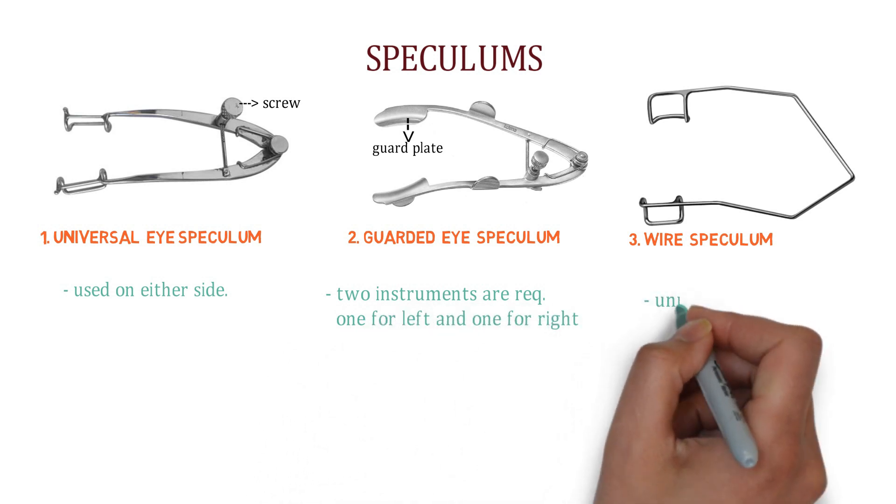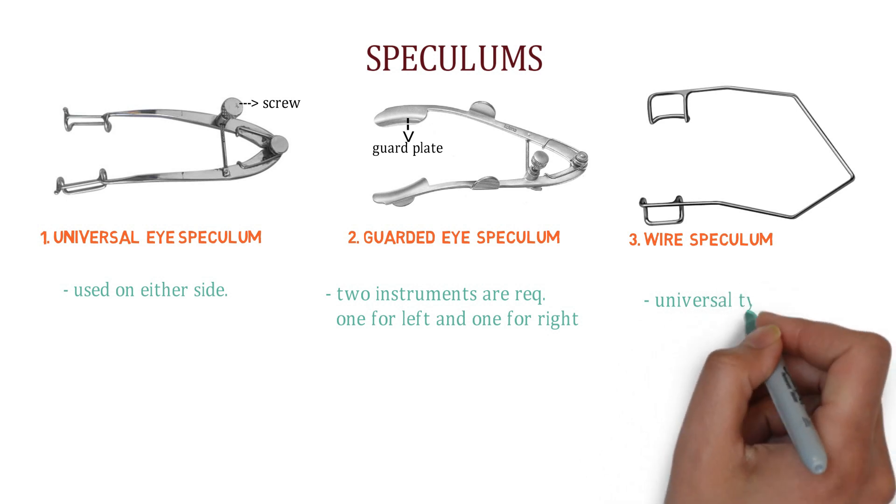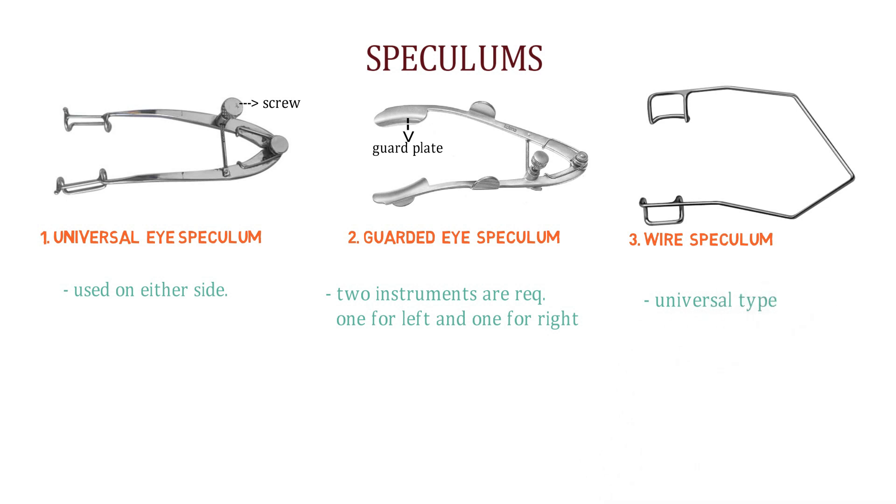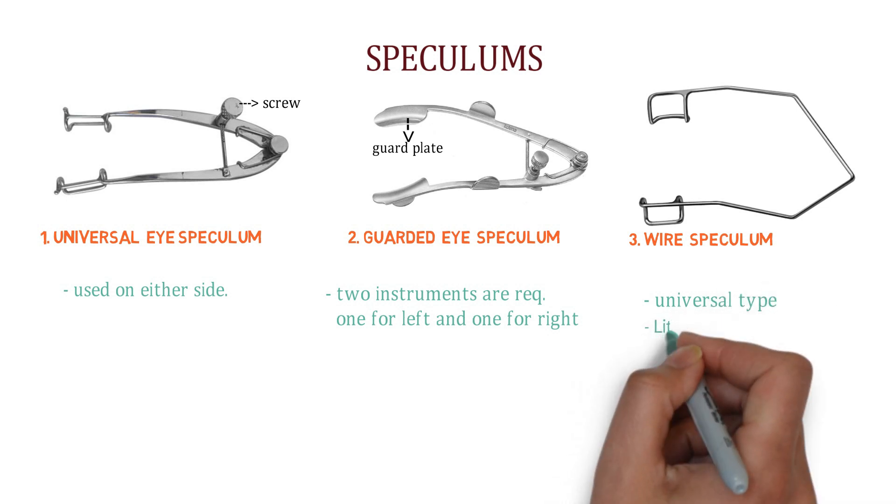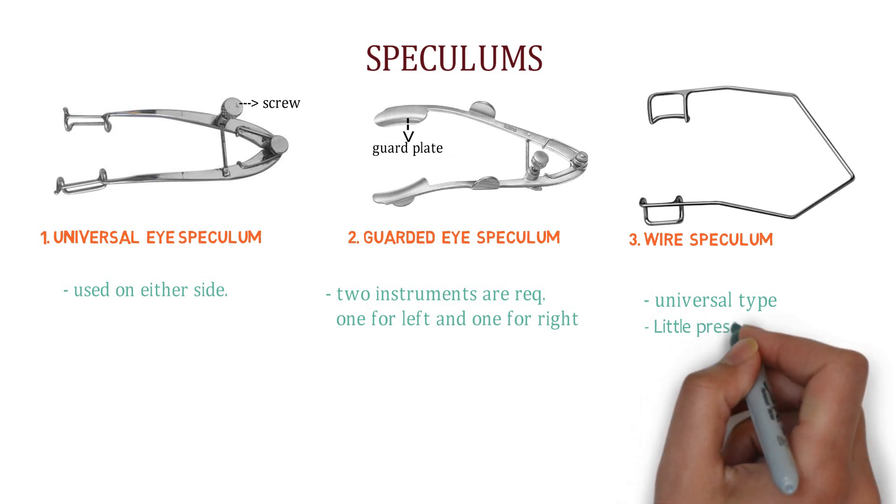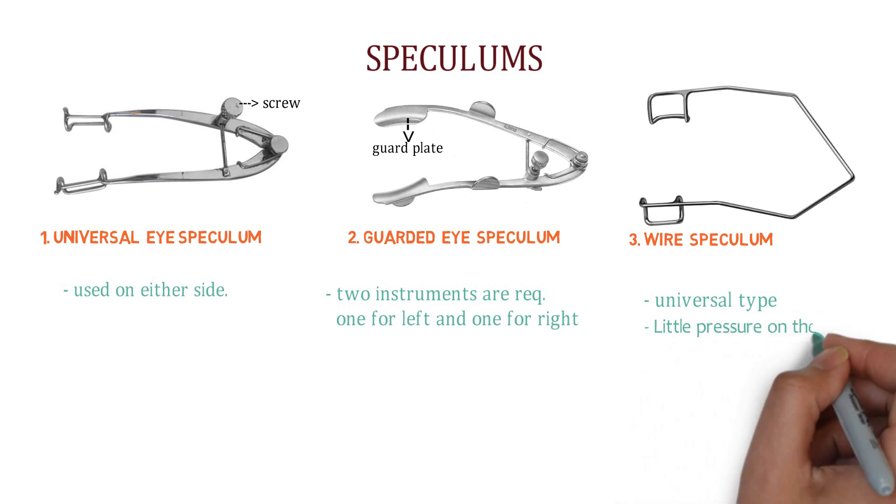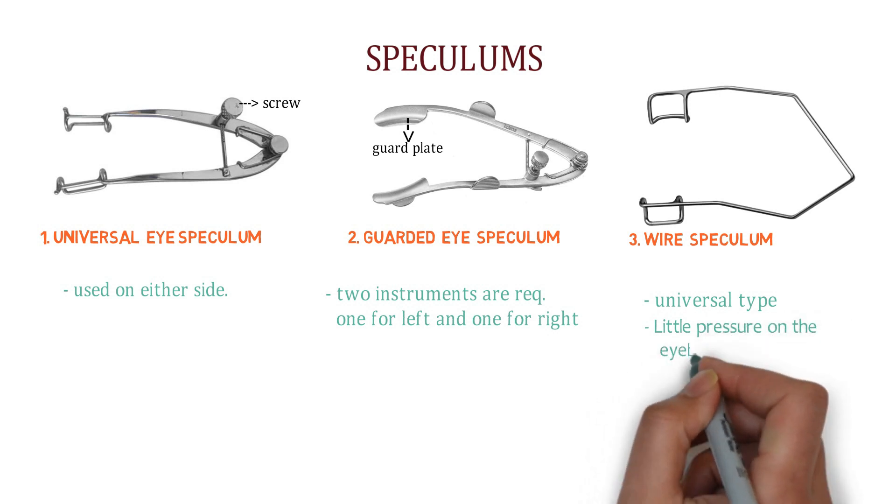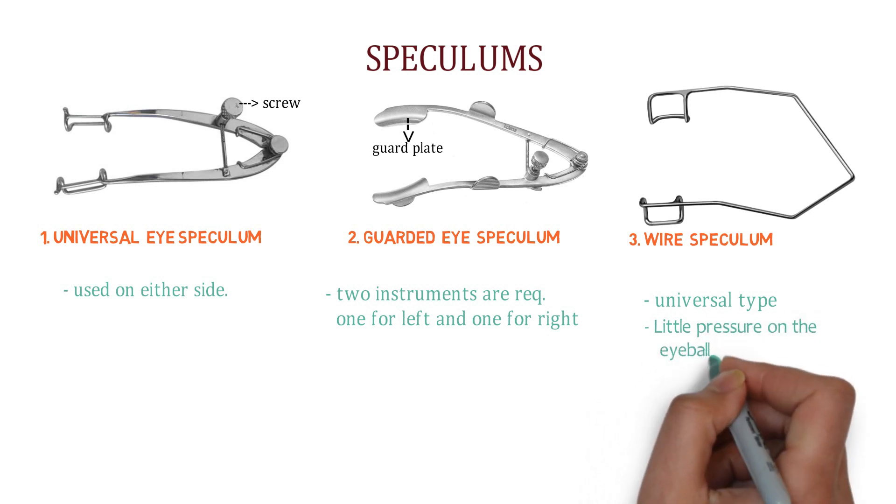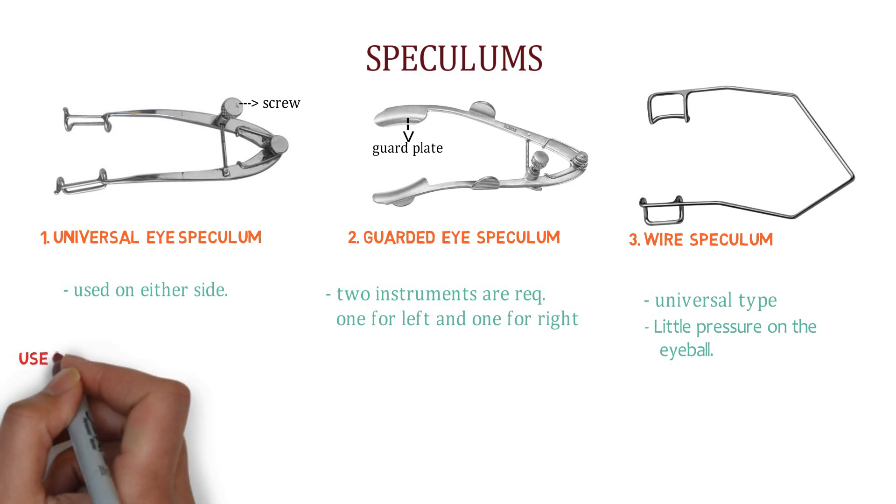And this third one is wire speculum. It is made up of stainless steel. Look over here. You can easily identify it because there is no screw. So it is very light in weight and hence gives little pressure on the eyeball. So it can be used safely during intraocular operations as well as extraocular operations.